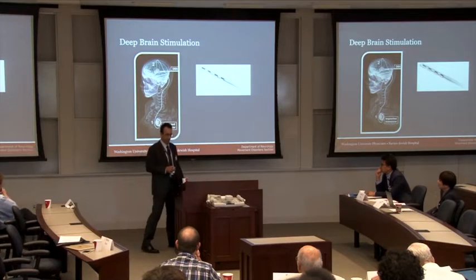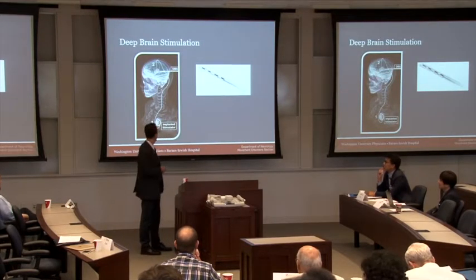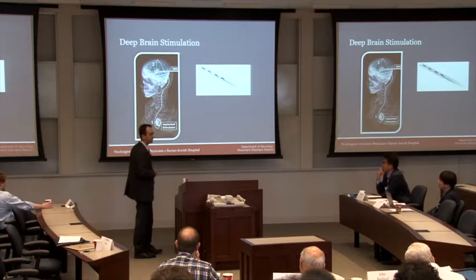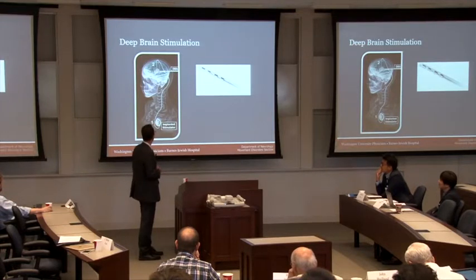I think first and foremost, deep brain stimulation surgery for us, simple, right? It's not rocket science, it's neurosurgery. And this is a slide that represents what we do here. This is a wire that we place deep inside the brain, in deep subcortical structures. That's achieved by drilling a very small hole in the skull. Following through that hole, we have a wire that connects to a device in the chest.